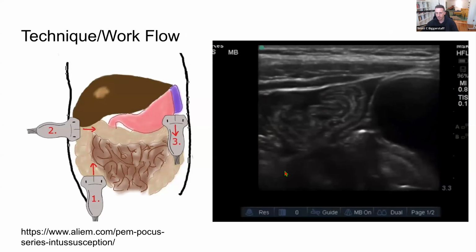Use cases for this, I think intussusception is one of those things where sometimes we don't always catch it on admission, even though the story seems to fit. And it could be because it reduced on its own. Then the patient comes in for observation and they have recurrence of symptoms, and you want to be quick to catch that. If you work at a place where you can save images to the PACS, I think this could improve time to reduction on the floor.